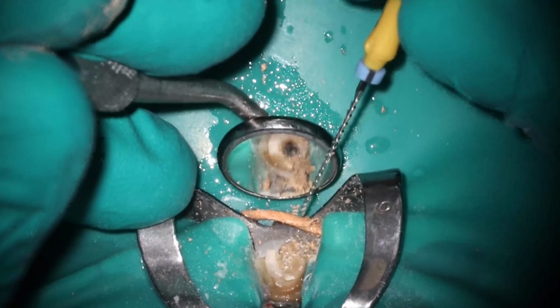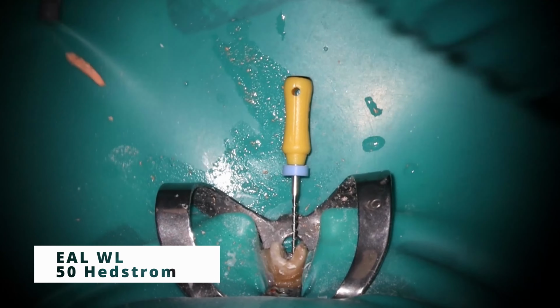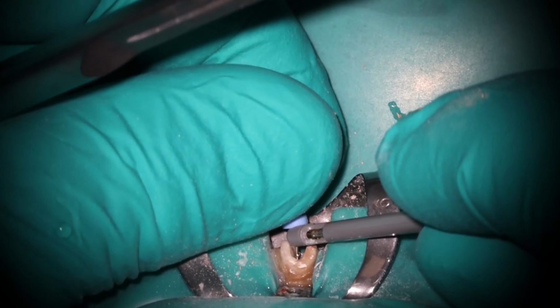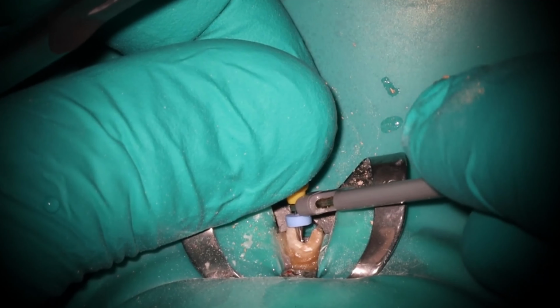In this case, the Hedstrom itself works by screwing it in. So literally I just righty-tighty, lefty-loosey, screw that thing in and pull. That's a very simple, straightforward answer. I'm also showing the entirety of how I did the working length here, because you'll notice with these large apical sizes, it's a little harder to get stability.